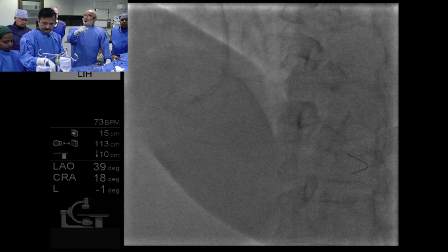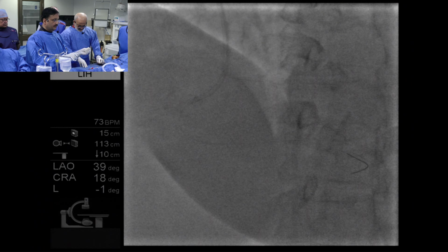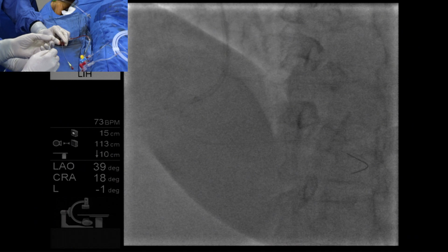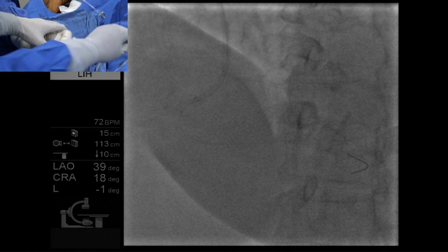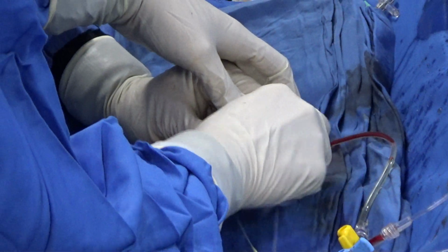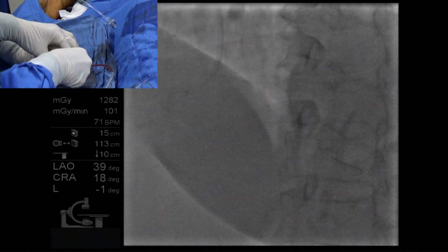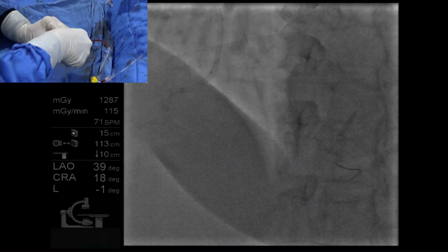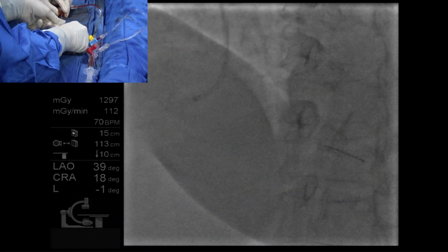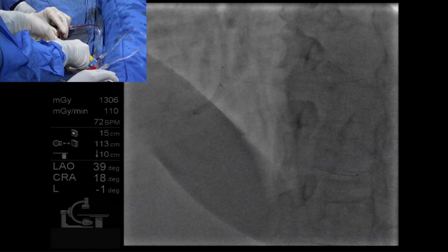Just show. Keep the camera focus here now, when Dr. Sanjay is going in. The balloon without anything is pushing, not even the PTC wire, not even a coronary wire. Nothing. Okay. I am pushing. Pulling back. Rajiv, can you see the pressure there in the room? No, we can't see the hemodynamics.